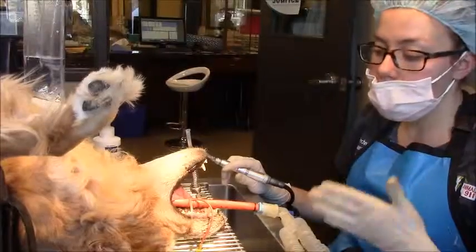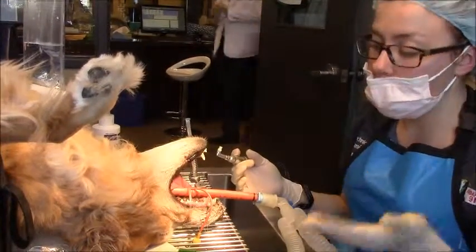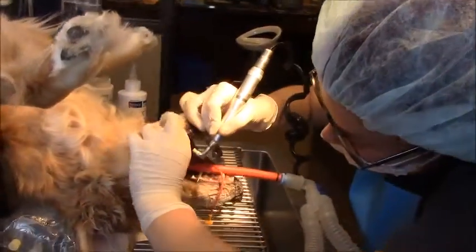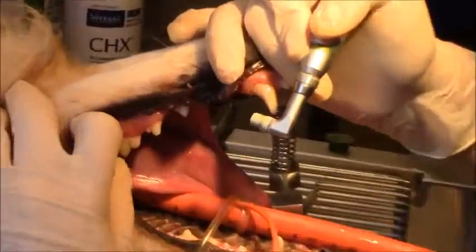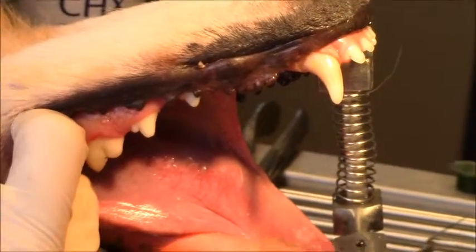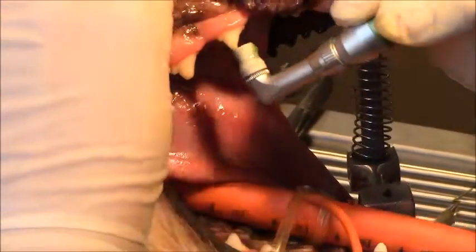Now that I have finished scaling the teeth, I'm going to be polishing the teeth to protect them from any further damage. Polishing works something like this — and as you see, there's a big difference now. There's also a little bit of staining that unfortunately cannot be removed from years of damage to the tooth, but I will start polishing to protect it now from any other buildup.